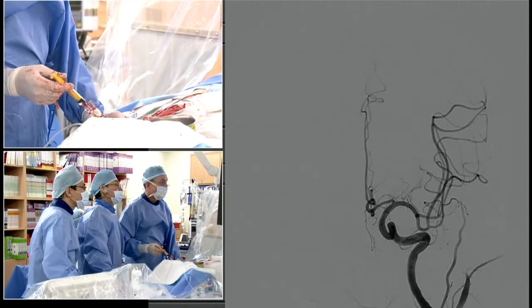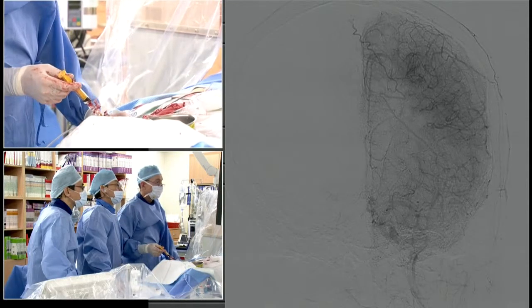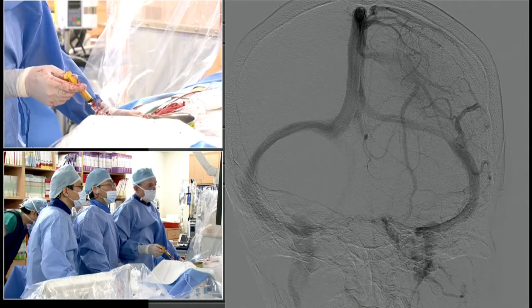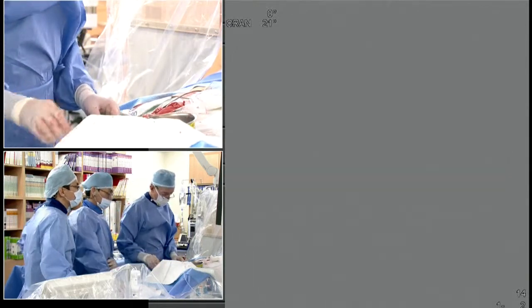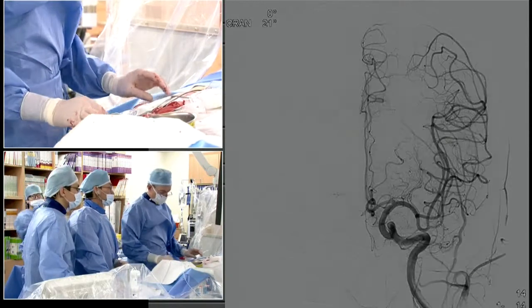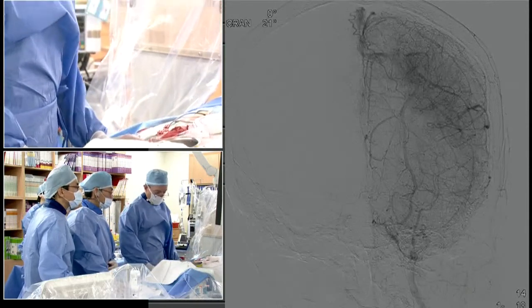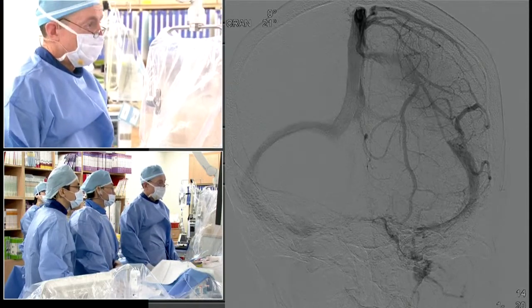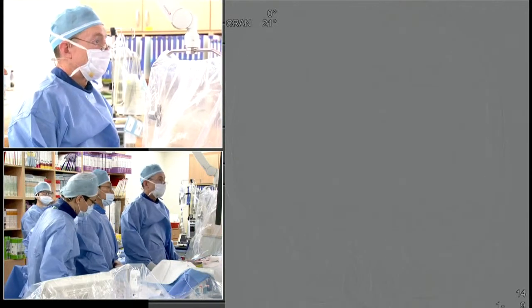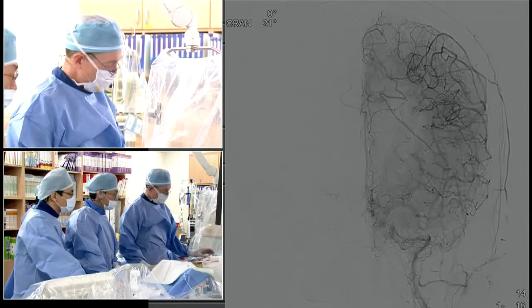So do you always do a post-procedural angiogram? You know, it depends on the patient. I think if we are in a protocol that requires it, we always do. If the patient has renal insufficiency, I always don't, if I can avoid it. And so I think in this case, to do a single AP cranial kind of reassures me that the cerebral flow is okay. But I think that in a straightforward case, it's not mandatory.